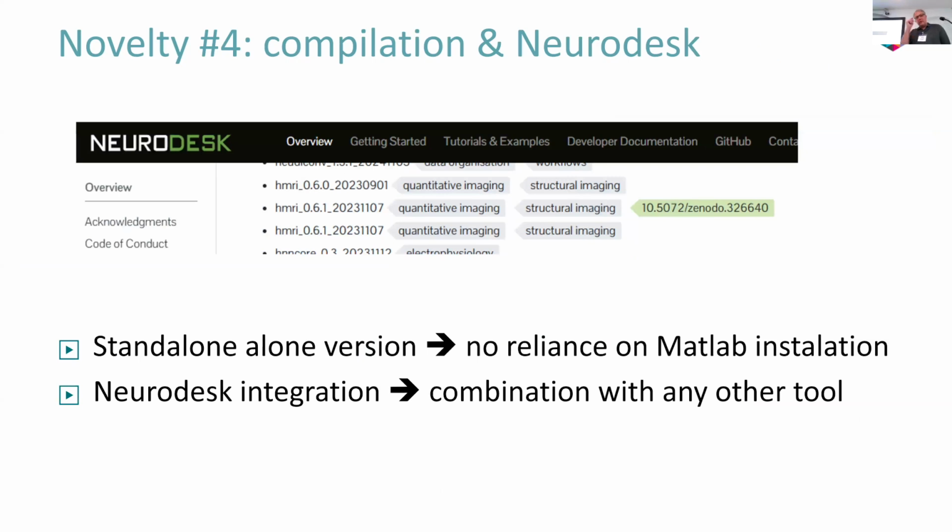That's improved. The package now has a standalone version on MATLAB. So it's compiled, it uses the MATLAB runtime, and it's also integrated into Neurodesk that was mentioned as well.